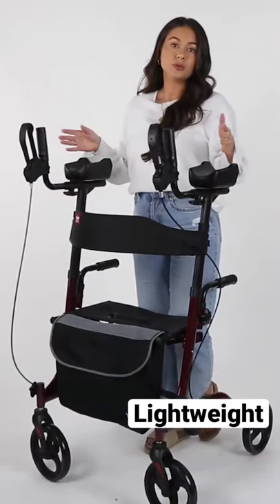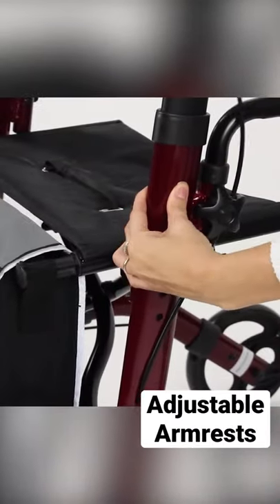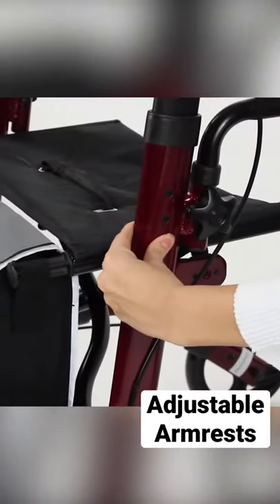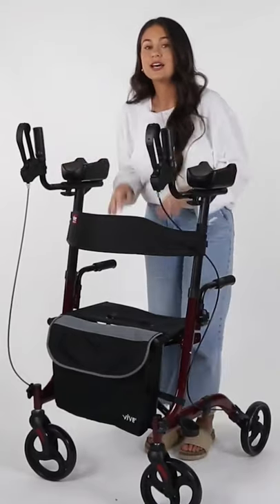It only weighs about 20 pounds and supports anyone up to 300 pounds. It has adjustable handles at the armrest measuring from 41 to 46 inches to ensure a customized fit.